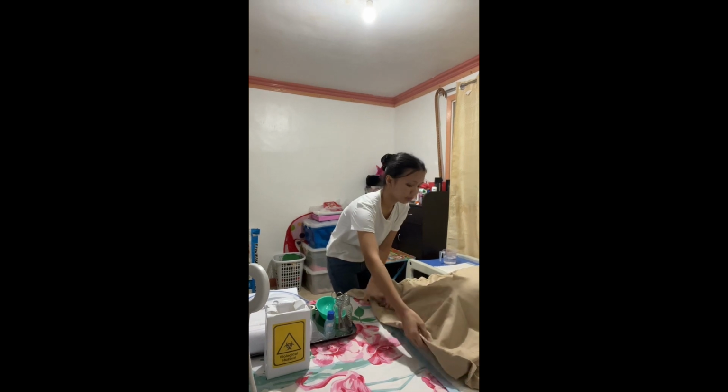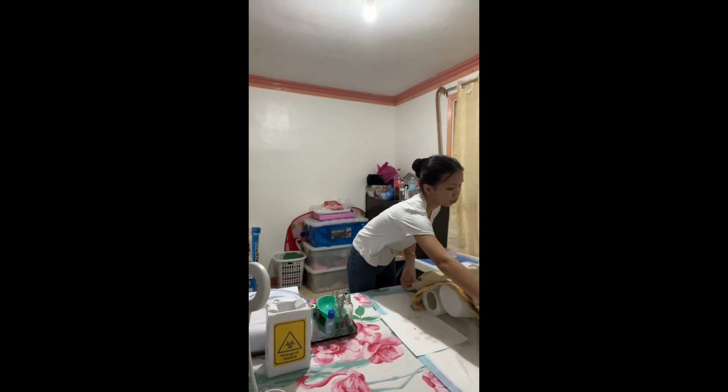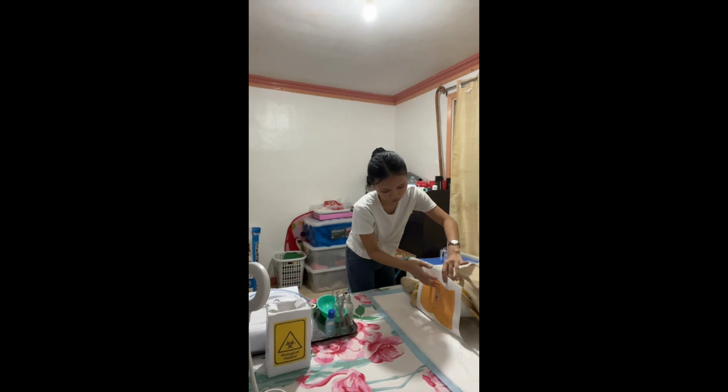Okay, thank you. Now we are going to drape the patient, exposing only the area to be used. Minimal exposure will lessen the embarrassment and helps to provide warmth for the patient. Now ma'am, I am going to drape the blanket and I will only be exposing the area that I will be needing to see.